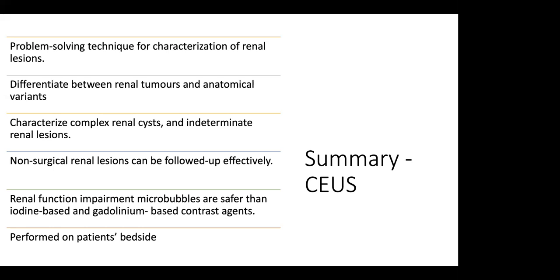Most sonographers are taught that if they see something difficult to characterize, they send the cine of that particular finding, even for the grayscale assessment. That makes the interpreter's job a little easier. But of course, the real time versus static thing is a technical limitation of ultrasound.